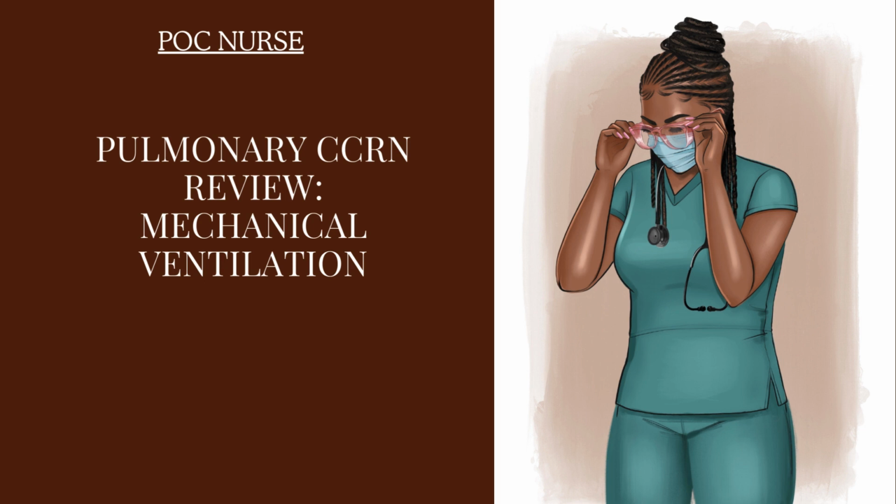So now, when a patient is on the mechanical ventilator, the ventilator is basically sustaining this person's life. The ventilator may be doing all the work of breathing for the patient. The ventilator may be assisting the patient with breathing, but all in all, this ventilator is keeping the patient alive. So it's important for that ventilator to work very well. Therefore, the ventilator comes with alarms that will go off if there's any kind of interruption in delivering oxygen to the patient. So when the alarms go off, remember the alarms are for the patient's safety.